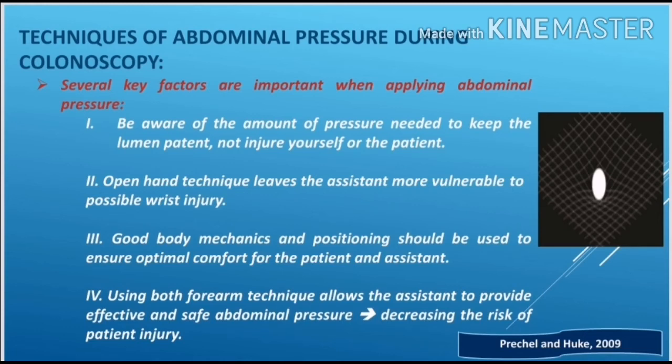Third key factor, good body mechanics and positioning should be used to ensure optimal comfort for the patient and the assistant. Fourth key factor, using the both forearm technique allows the assistant to provide effective and safe abdominal pressure, decreasing the risk of patient injury.